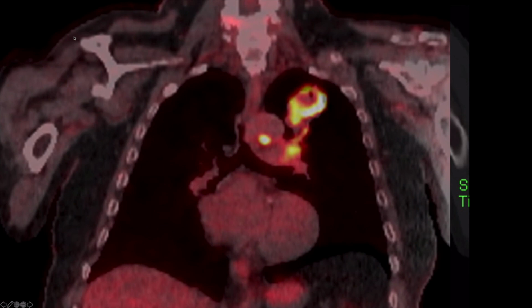So if you remember from this case, we can only see a lung nodule. But on the PET-CT, we can see the lung nodule lights up quite nicely, very much in keeping with the cancer. But we can also spot two other sites of increased uptake in the mediastinum, and these actually relate to lymph nodes. So the scan has been able to pick up additional sites of cancer that may not have been picked up on anatomical imaging alone.